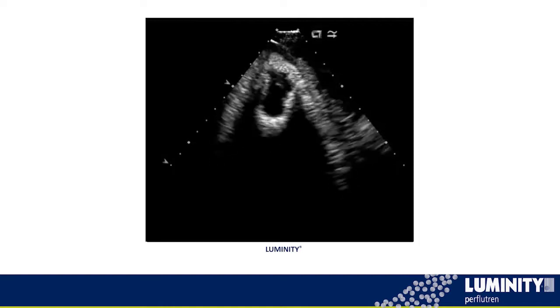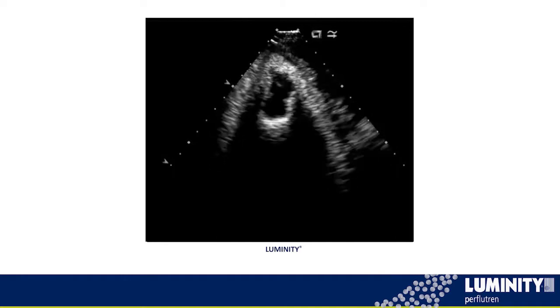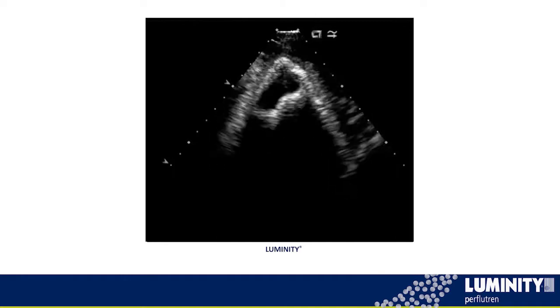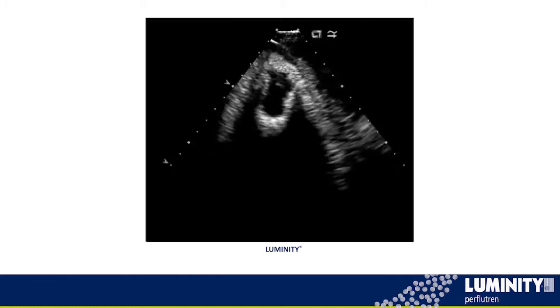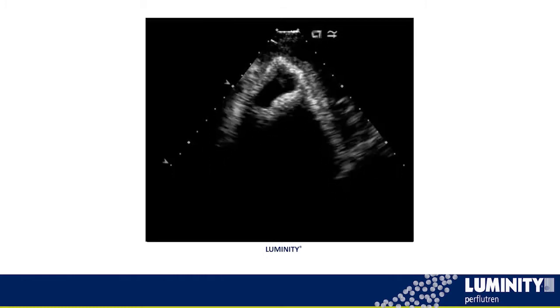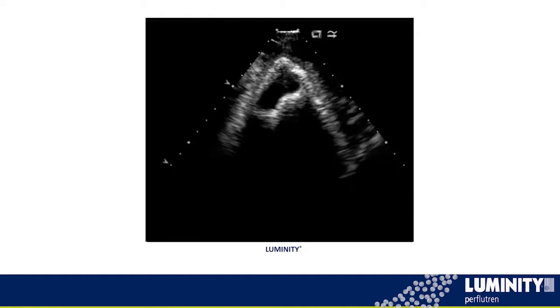In this frame, it looks like the thrombus is just floating in the apex. There's an attachment somewhere, so I would want to sweep. You get a little glimpse of the attachment there, but it's very important to give sometimes a faster injection, maybe more Definity, in order to see the apex when you can't.